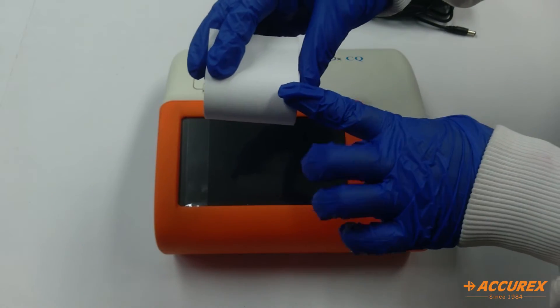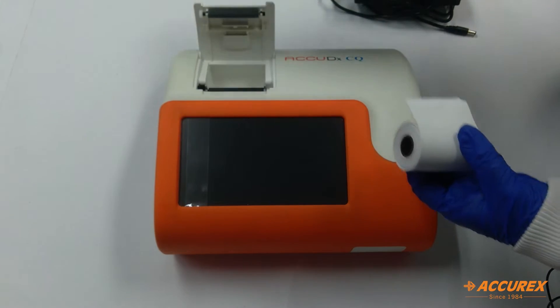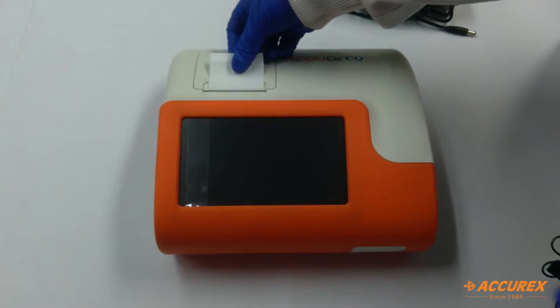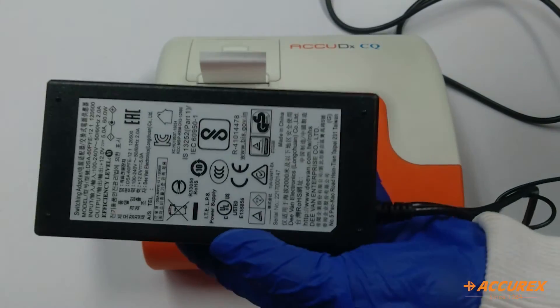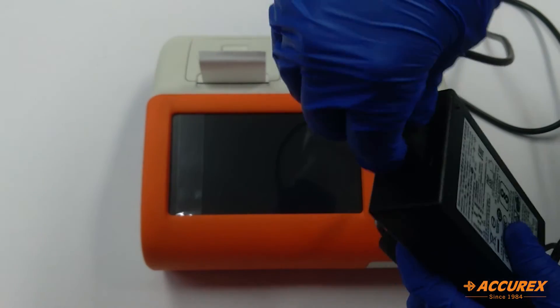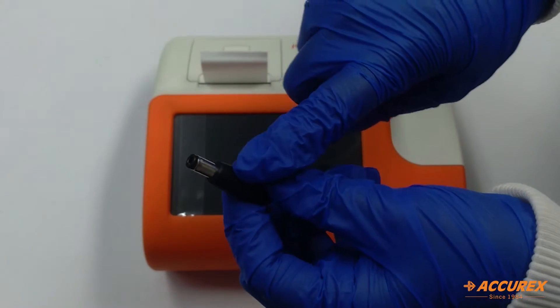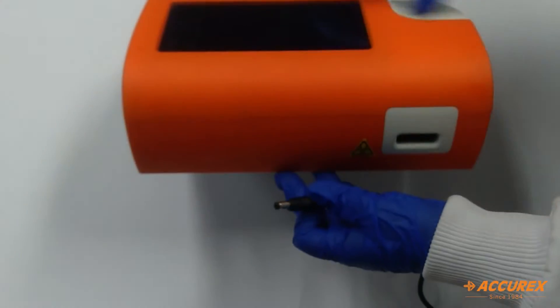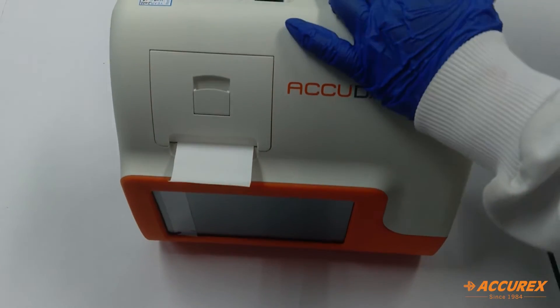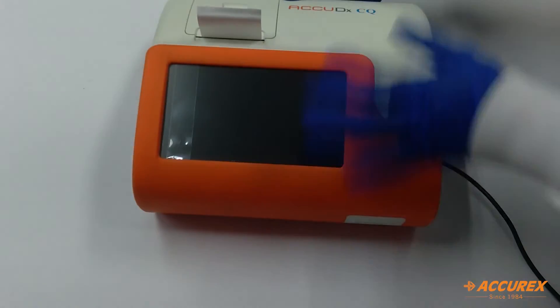Now we will see how to insert the printer paper roll. We will pull this up, insert the printer paper, and push it back. This is the power adapter and this is the power cord — we will insert this slot in this. The pin of the power adapter is to be inserted at the back side like this, and then we will switch the analyzer on.